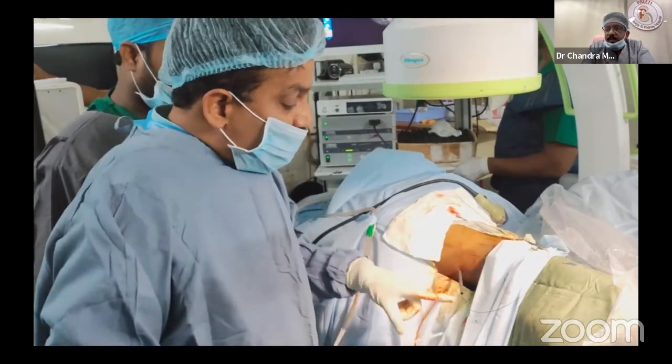This sucking out of the blood clot and the pus is very important in a mildly infected system where you are doing PCNL. If you suck out constantly by putting water externally and taking it out, it empties, especially the initial clot, one or two. I will show this. It will be emptied and the stone will be nicely seen. Then you can proceed with this.